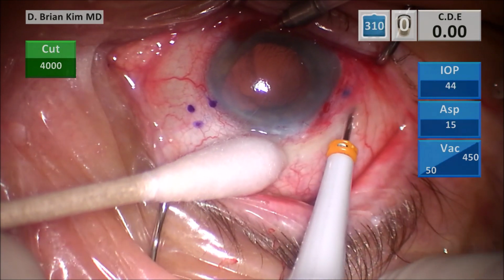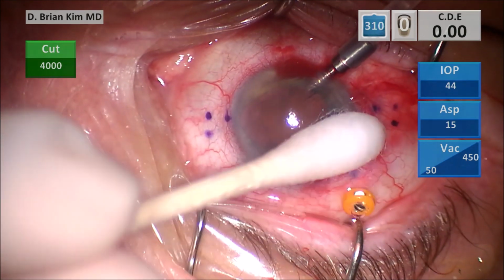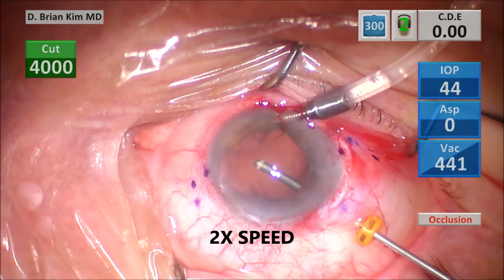tunneling to the sclera, and then turning near perpendicular and then entering. And the sign of a self-sealing trocar scleral incision is when you take the blade out and the trocar sits slightly tilted in the sclera.